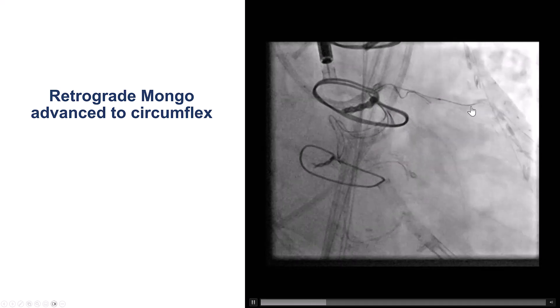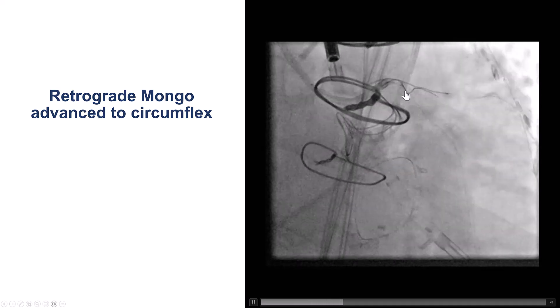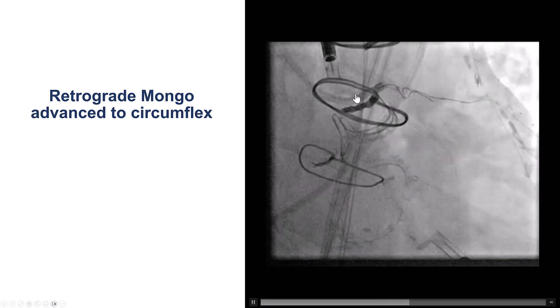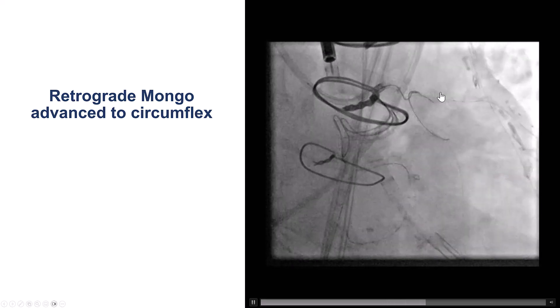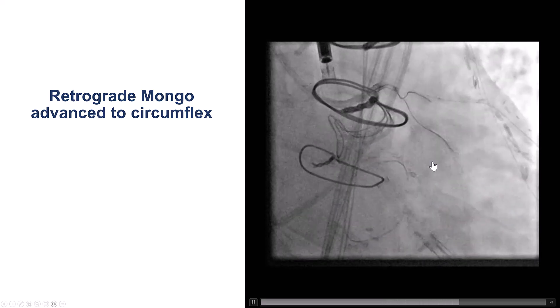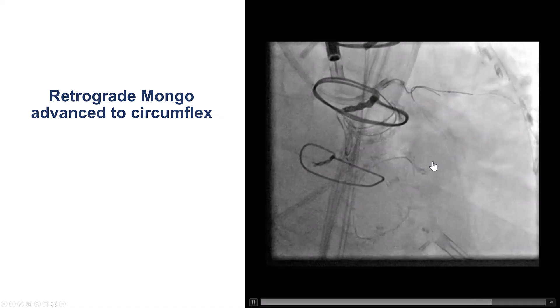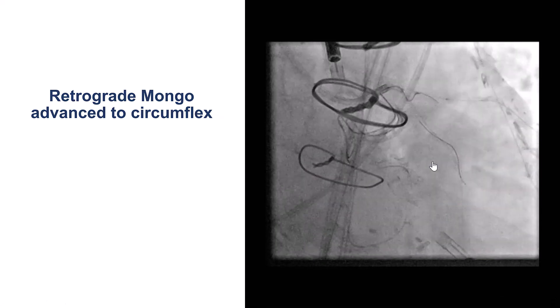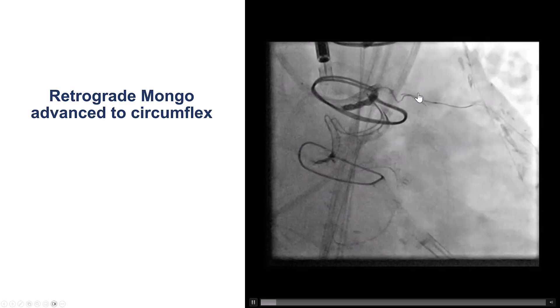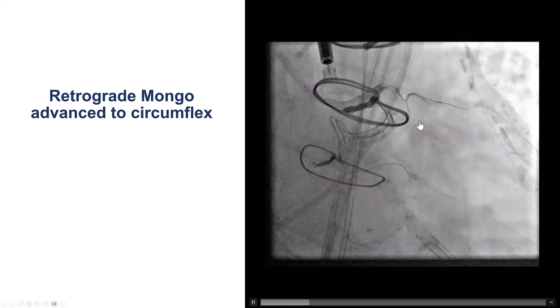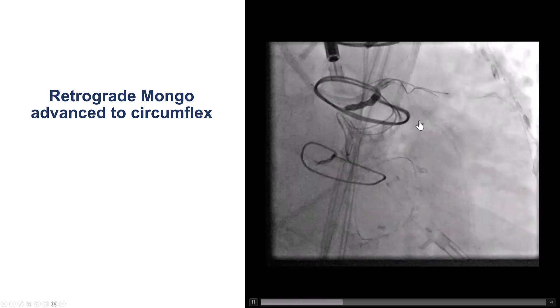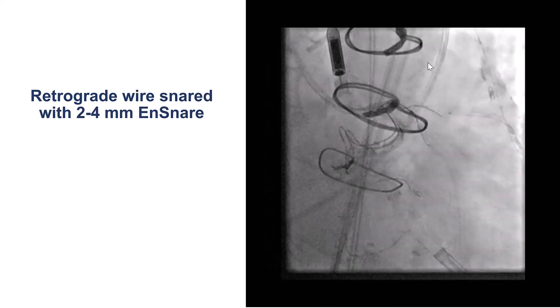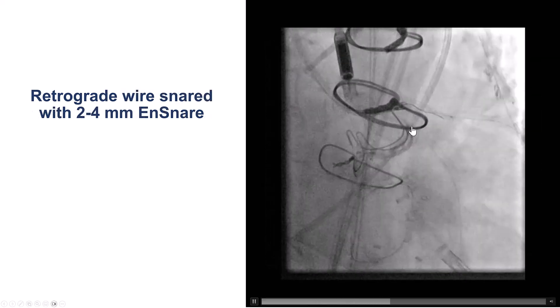We finally manipulated the retrograde guide wire once again. The retrograde wire initially seemed to go into the left main, but then eventually went down into the circumflex. So what to do next? Should we pull it back and try to rewire again, or do something else? What we decided was to snare the retrograde guide wire.